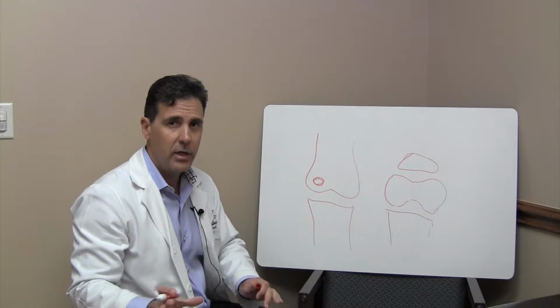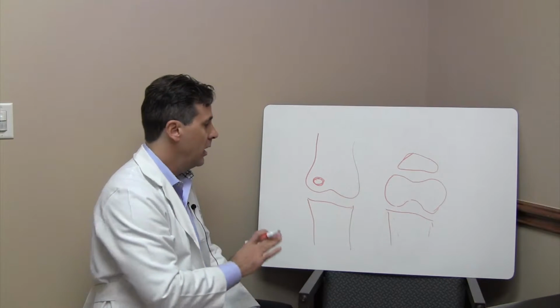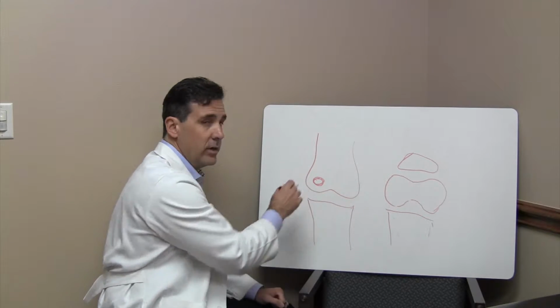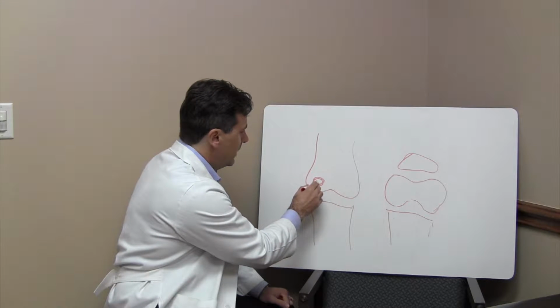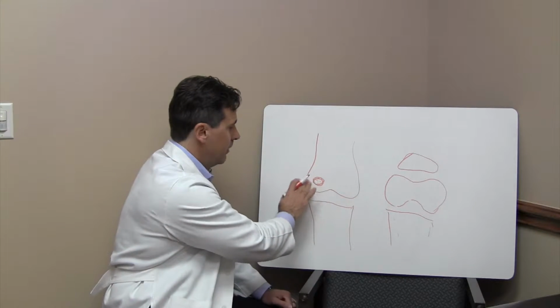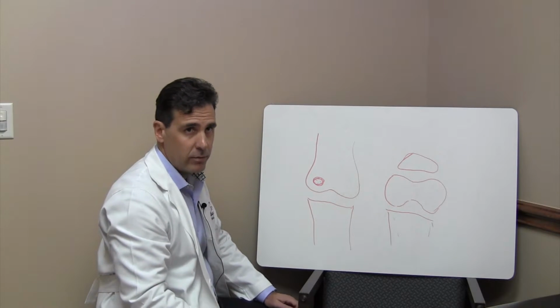It just doesn't work. You have to have small isolated lesions in certain areas of the bone where you would be a candidate, and you cannot have arthritis on both sides. It has to be only on one side. So what we do is we go in arthroscopically and create little drill holes in that exposed bone, after we remove the calcified layer and expose the underlying subchondral bone.